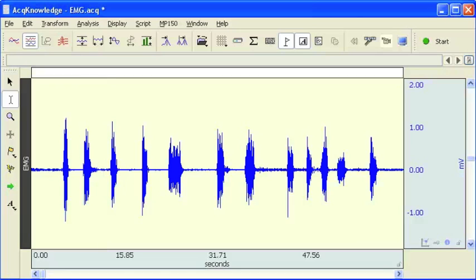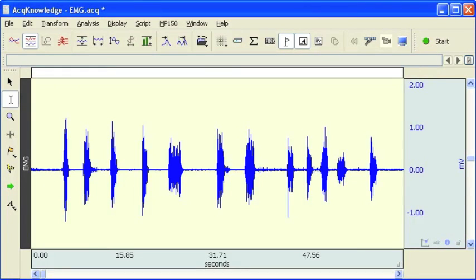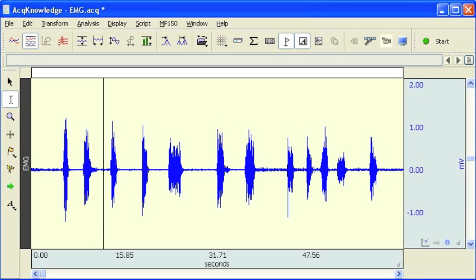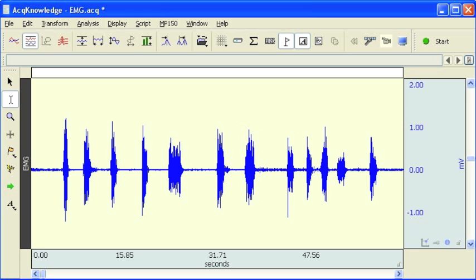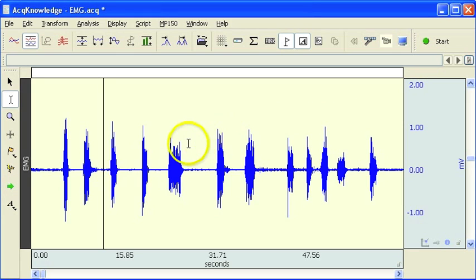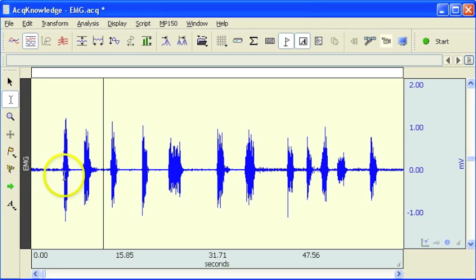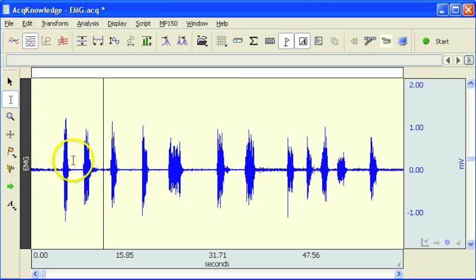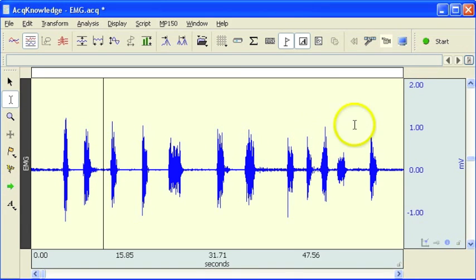The following screencast will provide you with an introduction to the AcqKnowledge Automated EMG muscle activation routine. This is a useful tool for identifying when periods of muscle activity occur within a file.